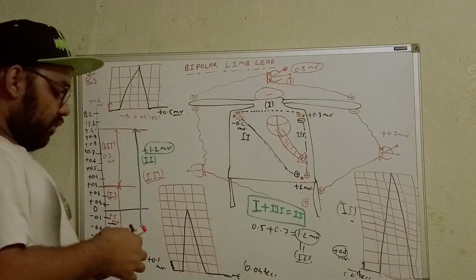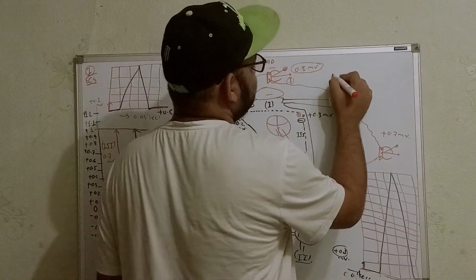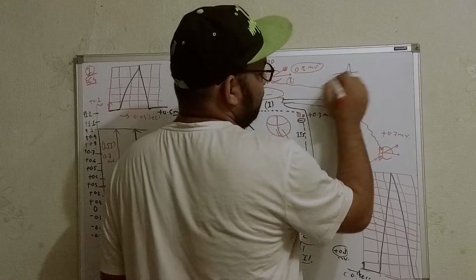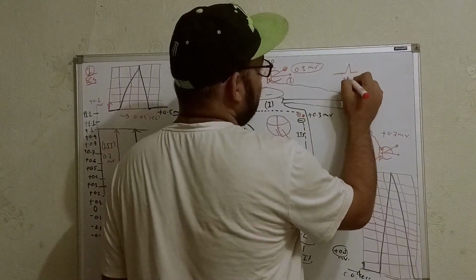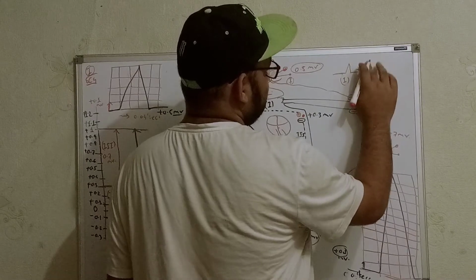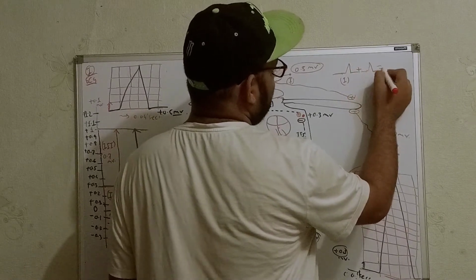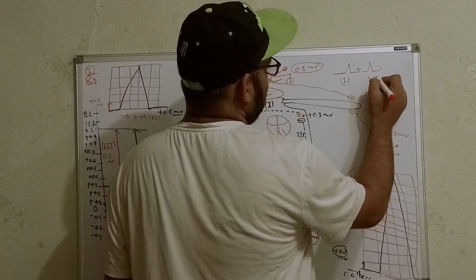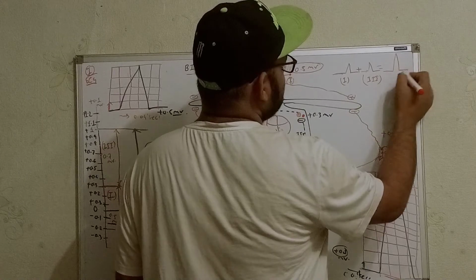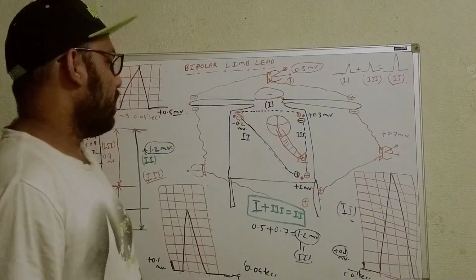Okay. Now for simplicity, I am just saying in terms of the ECG. For example, I got lead number 1 in terms of the ECG, and for example, lead number 3 reads in this way only, and that will be equal to, definitely it will be greater, lead number 2. So in this way we can represent Einthoven's law.